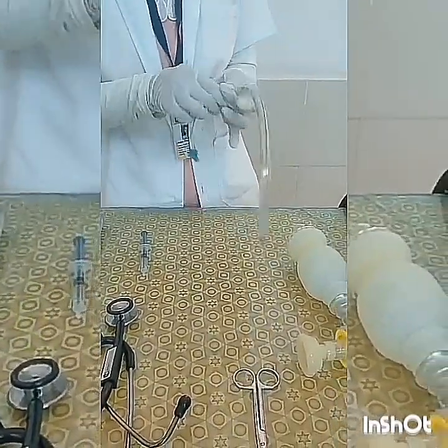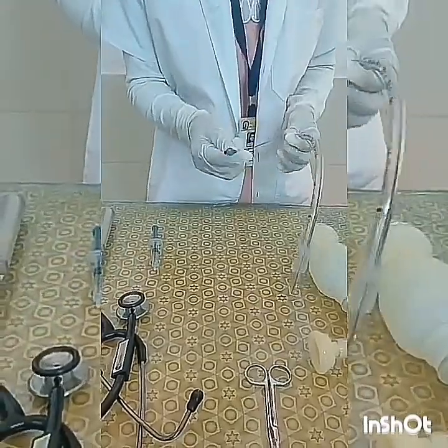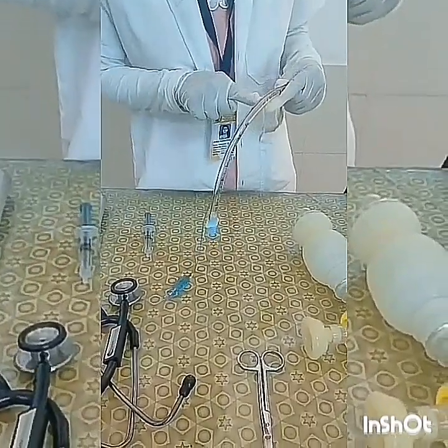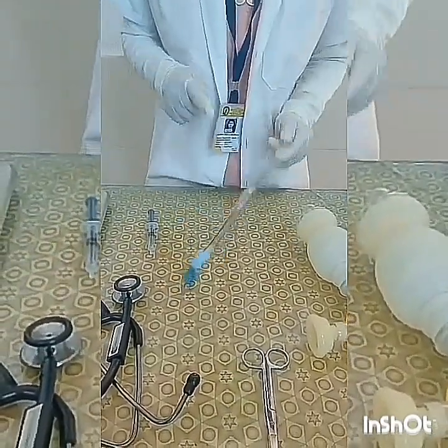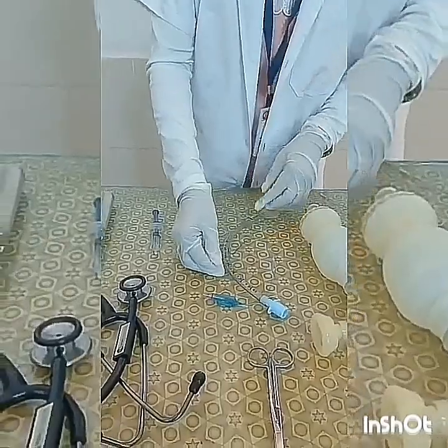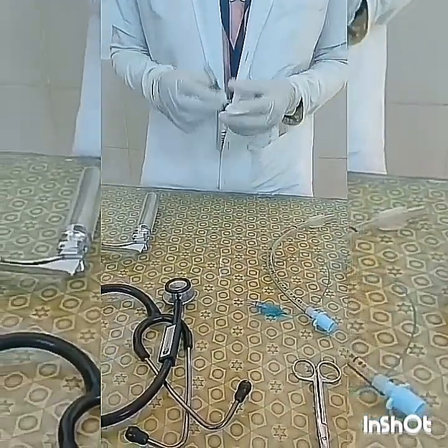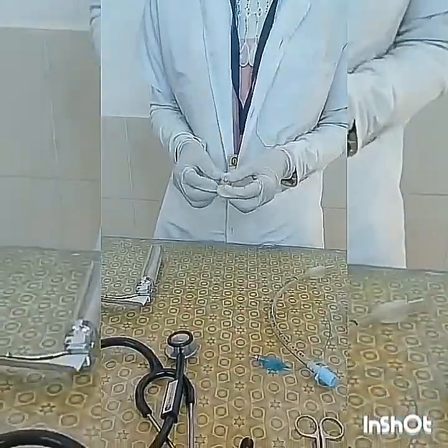This is the curve shape. It has the pilot balloon and inflation tube. It has a blue line, that is a radio-opaque marker. This is for inflating the cuff during the intubation.